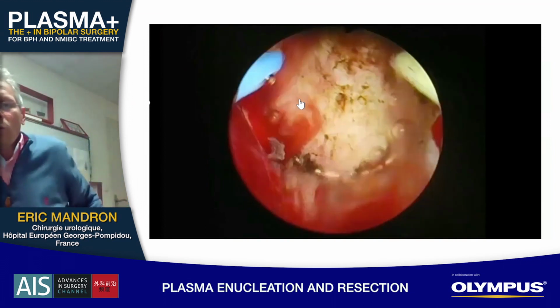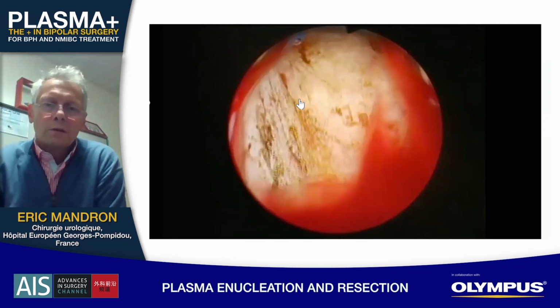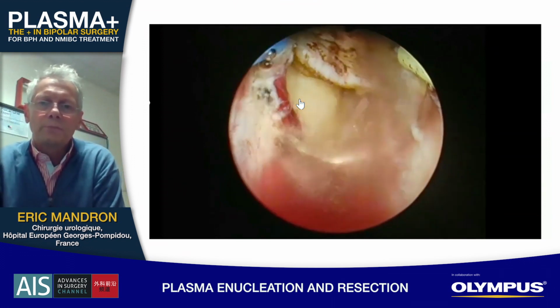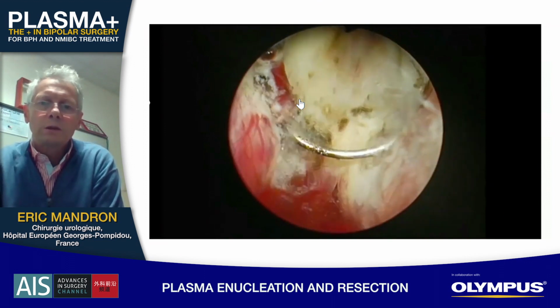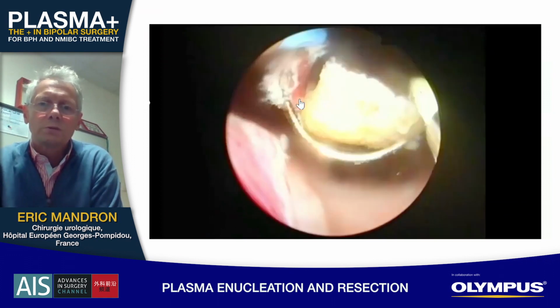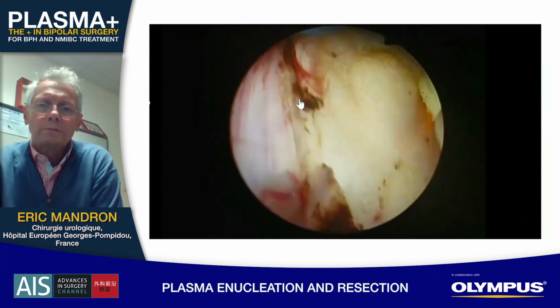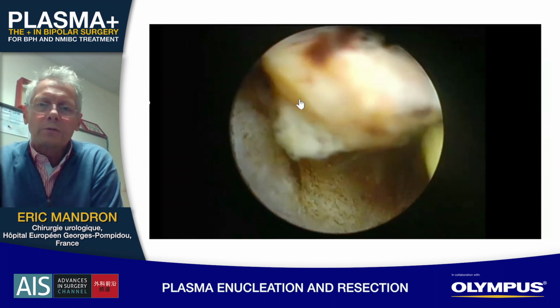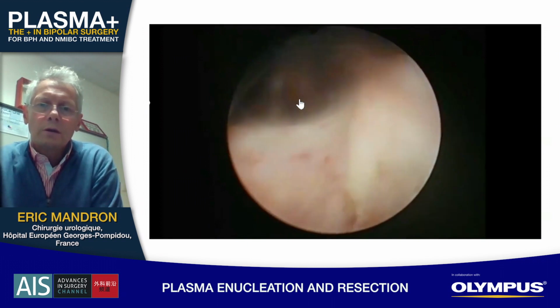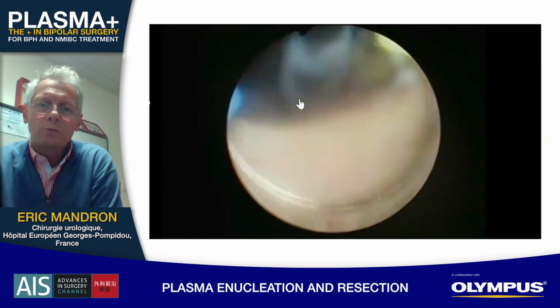To do it very well, it's very important to have the liquid with physiologic serum heat, then it will help to do a better coagulation, and also with a great pressure to have a good vision. So you can have an instrument to have a good pressure on the bag, or you can also leave the bag very high in the operative room.